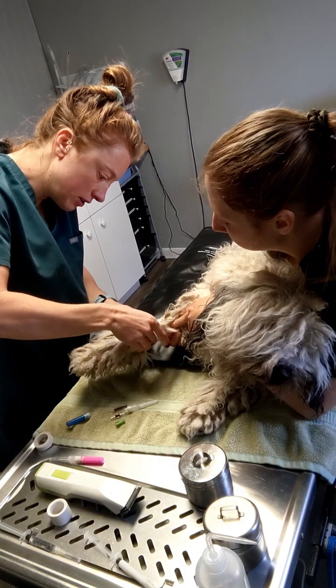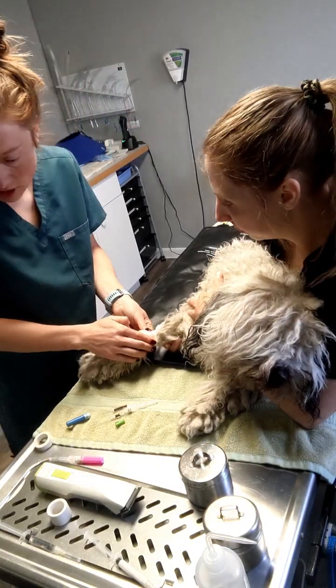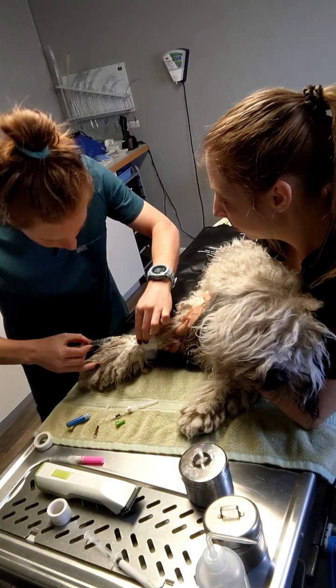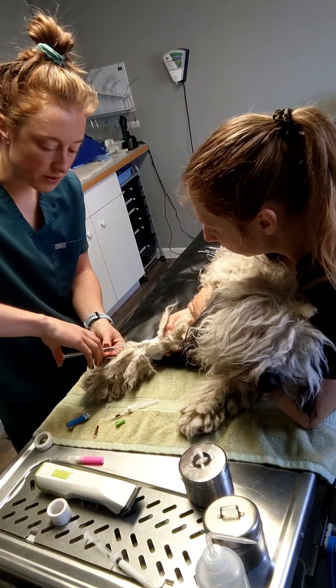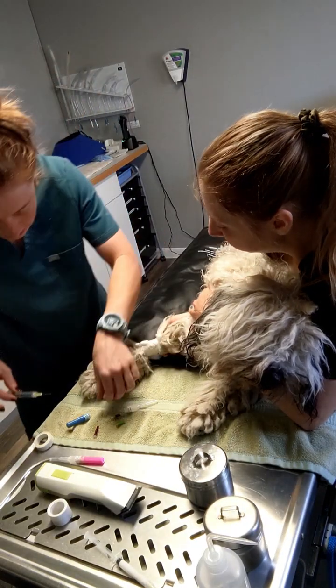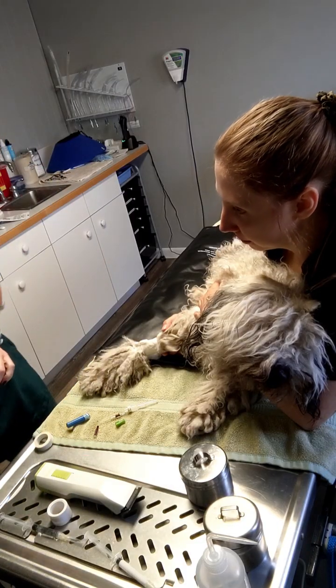Alrighty, I want to flush to make sure that I've got a good line in the vein. And Jackie's going to feel further up the leg just to make sure she can feel this flush go through. We're good. Okay, so now we're going to start with our propofol.